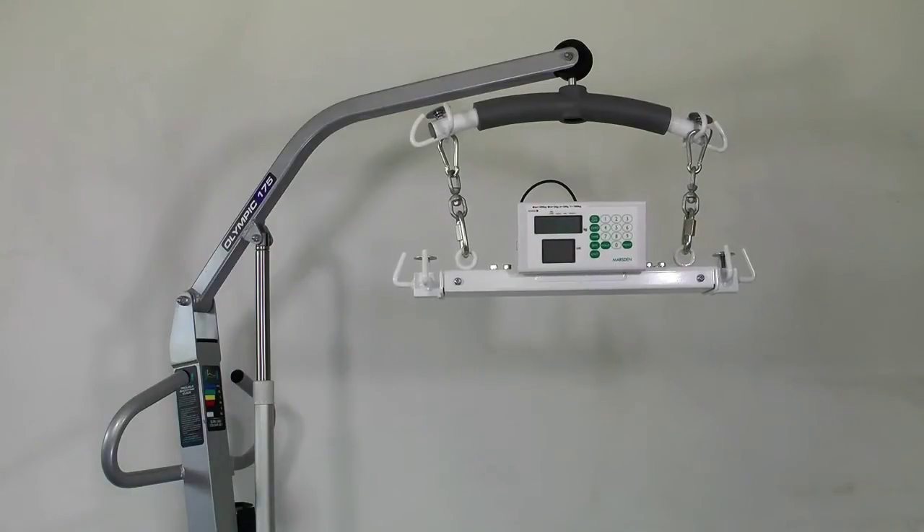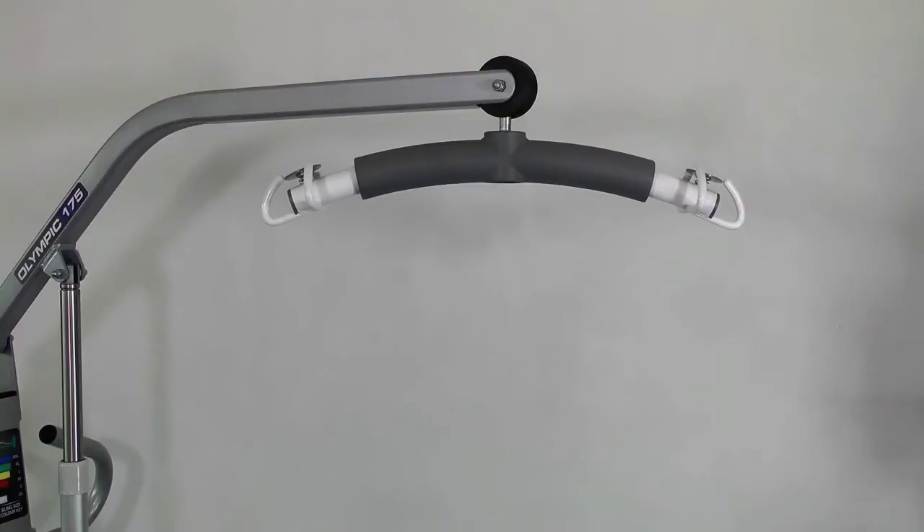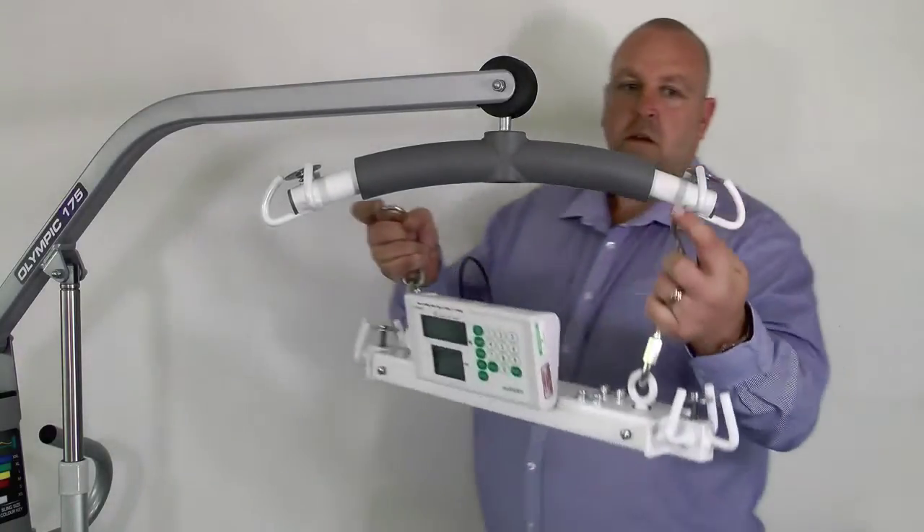The Mazden M600 is a hoist weighing scale for use on all patient hoists with integral coat hanger shaped spreader bars. The Mazden M600 is simple to operate so you can easily weigh less able or bedridden patients accurately. It's Class 3 approved, accurate to 100 grams, and also comes with a BMI measurement. The scale weighs up to 200 kilos, but remember to check the maximum safe weight of the hoist you're using.